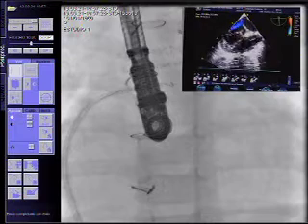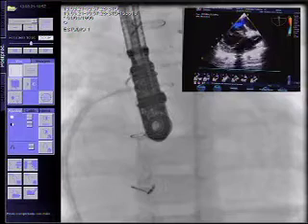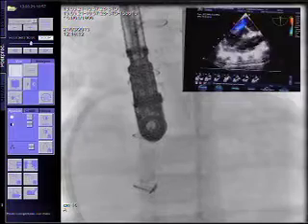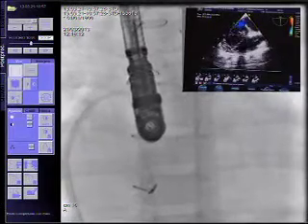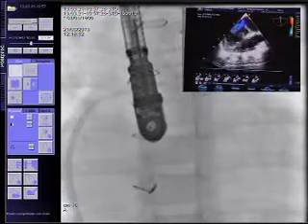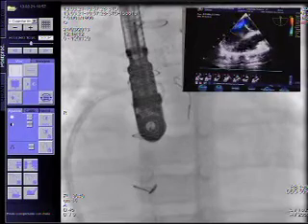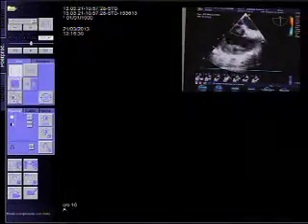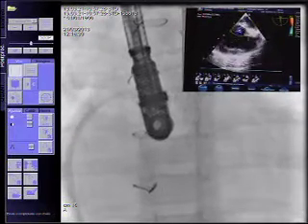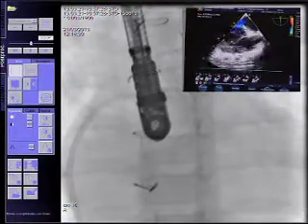So I think this is an extremely interesting case. We're probably going to have to break now to go to lunch. So maybe you can record for us, because I think you're going to be back for another case later on, aren't you? Okay. So maybe you can record all the steps so that you can tell us later on, because it isn't an uncommon clinical problem that we face, where there's an inadequate intra-atrial communication in these single ventricle patients. So thank you very much for showing us your steps, and I wish you good luck with the rest of it, and we look forward to seeing how you get on later on. Okay, we'll tell you. So thank you.